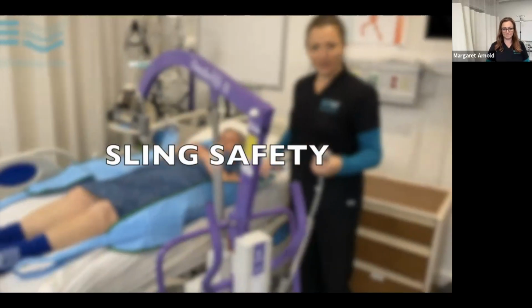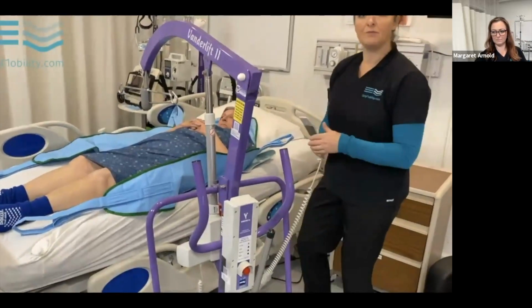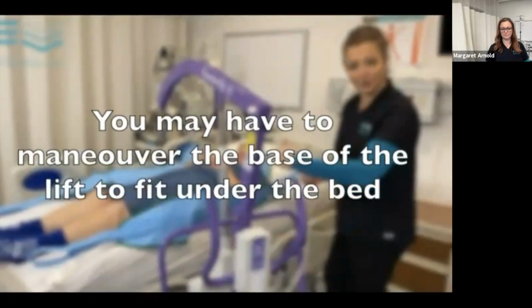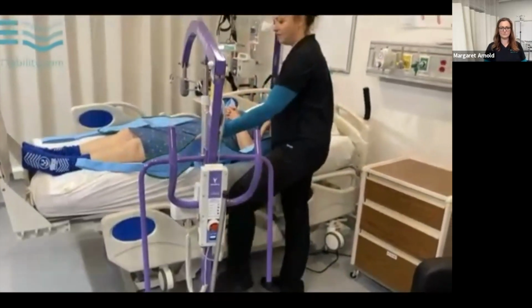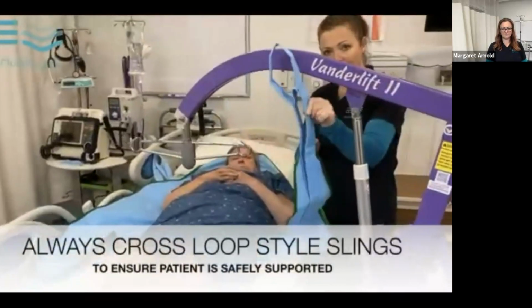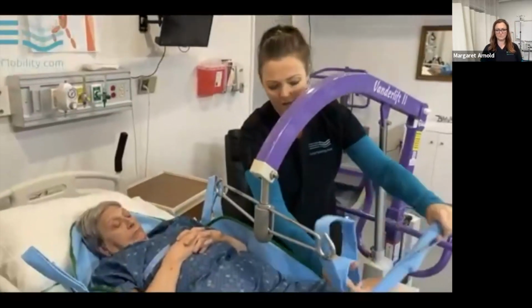We talked earlier in the lift module about placing the base of the lift under the bed and knowing where your spots are that you can move that wheelbase underneath. And for a loop style seated sling, always crisscross the loops when we reach underneath. We are looping them through.